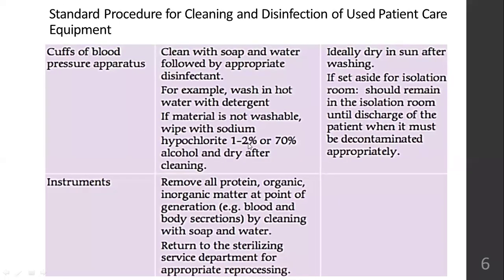Any instruments that have been used on the patient, laryngoscope, artery forceps, or any instruments, make sure you remove all the protein, organic, inorganic matter at the point of generation. If it is an OT, soon after the surgery is done, in the OT itself, manual cleaning or enzymatic cleaning has to be done, and then it will be sent to the sterilization department.